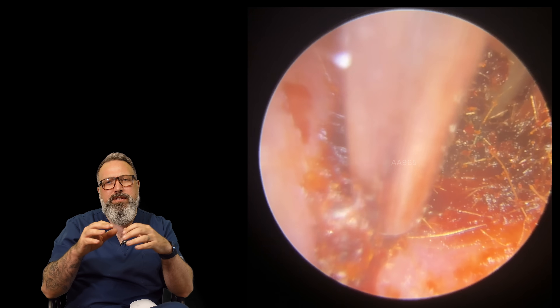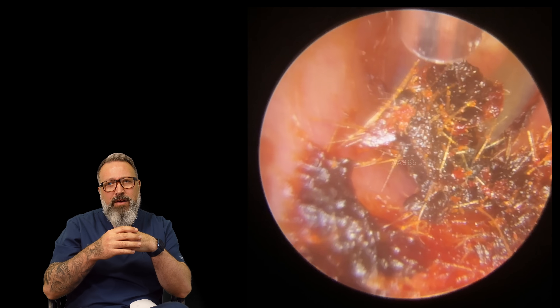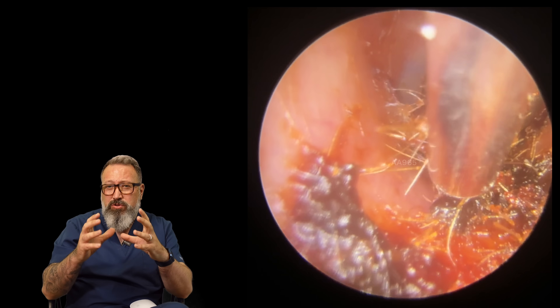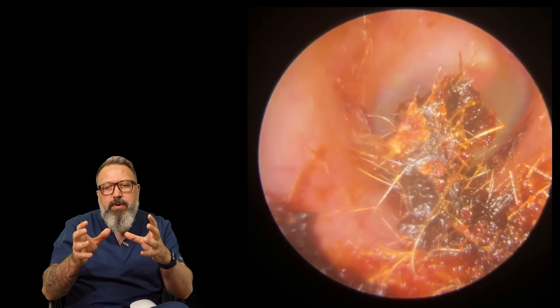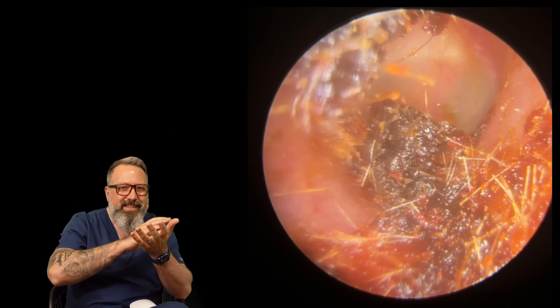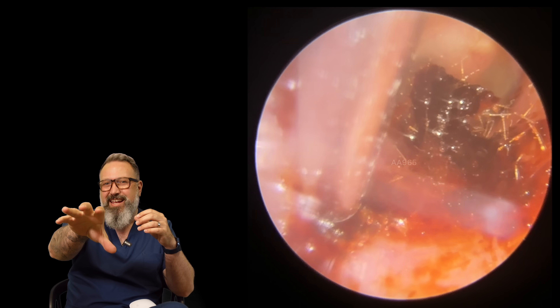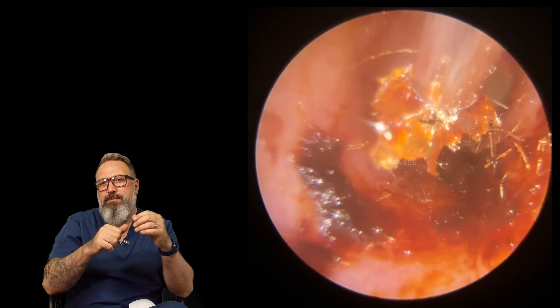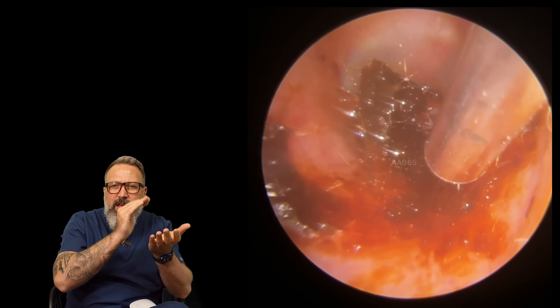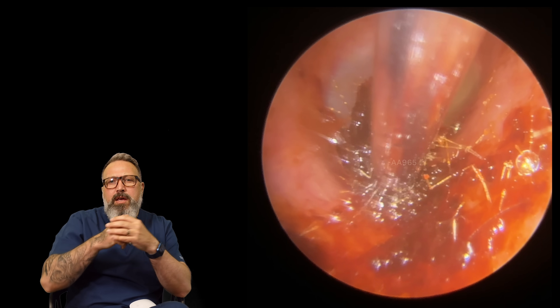As we're peeling here, it's just these thick dead skin layers - the surface epithelial layer that's come off the canal wall. I've got the fine end on the Zoellner tube here, and the reason I've opted for the fine end rather than the wider Zoellner tube is because it gives you a bigger degree of control when taking these thinner pieces off.